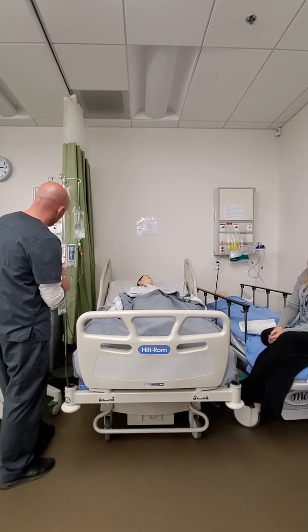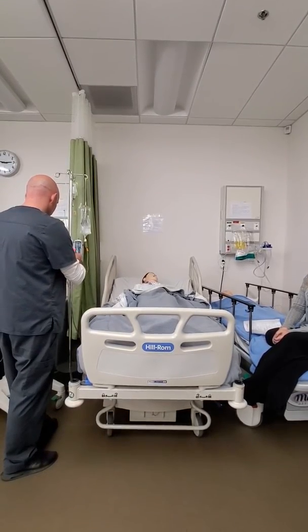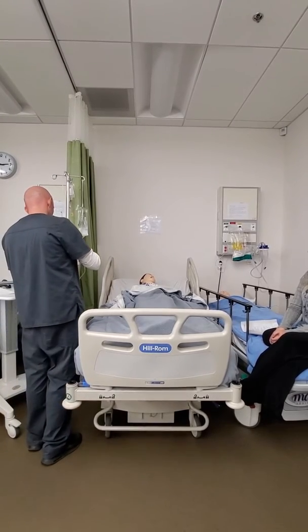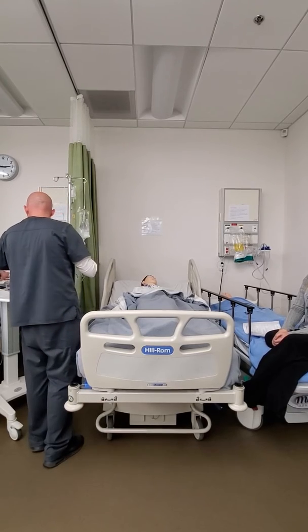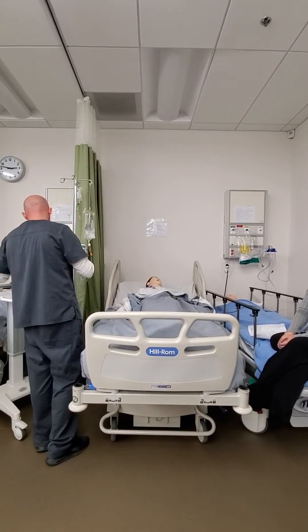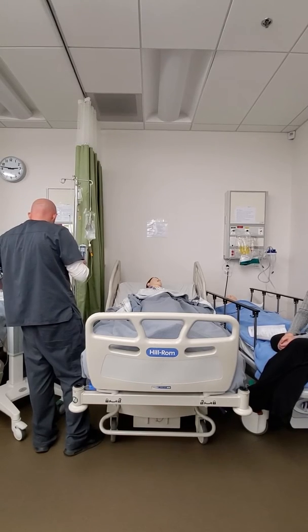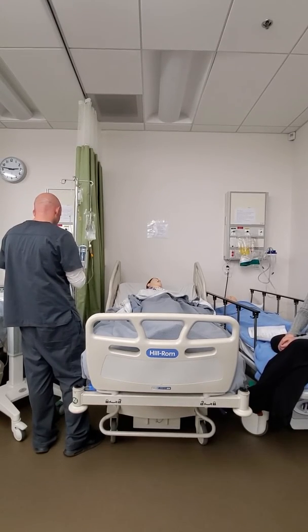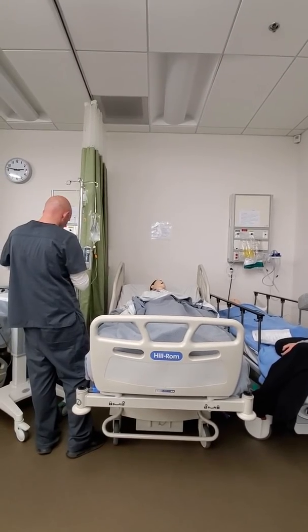So once I have the secondary line purged, then I can take this out. That can just go in the trash, as long as there's no patient identifiers.